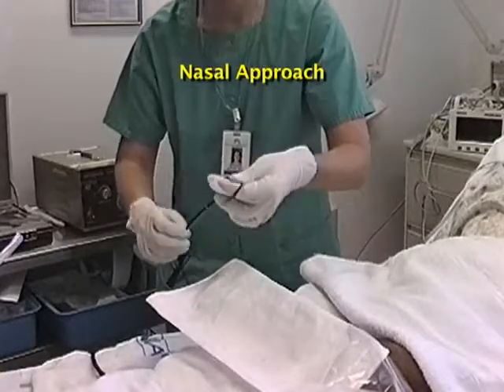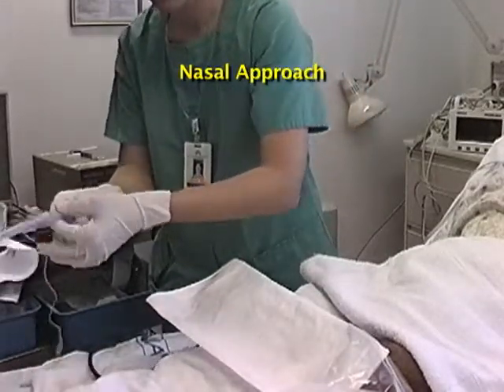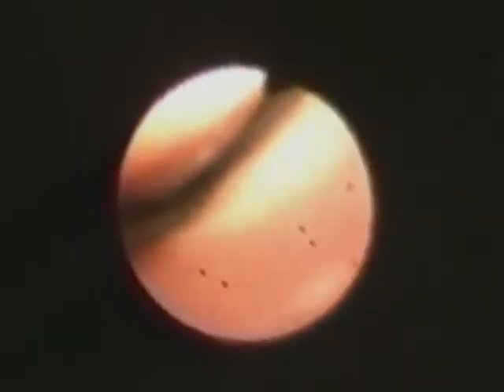For nasal intubations, the tube may either be kept back on the cable or advanced through the nose until it just turns into the posterior pharynx. Either way, insert the tip of the fiber into the nose and identify the inferior turbinate. Stay in the middle of the channel to avoid brushing against the sensitive and capillary-rich mucosa.